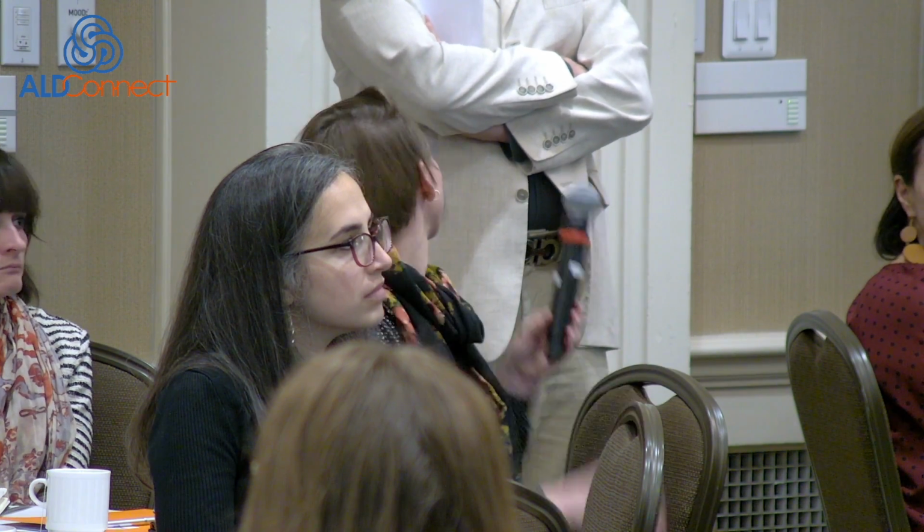Hi, Eric. Thank you for that great talk. I love looking at the earlier stages of the disease, the presymptomatic stages, and things that change before we know what's really happening. I love that you go towards FA. Have you considered other things like free water measurements as earlier potential neuroinflammation measurements than gadolinium enhancement, or other types of white matter integrity measurements as well? Yeah, great question. Absolutely. We can pull all six eigenvalues out and generate any variable we want. And the other part is we are looking at myelin water fraction. That's the other modality.